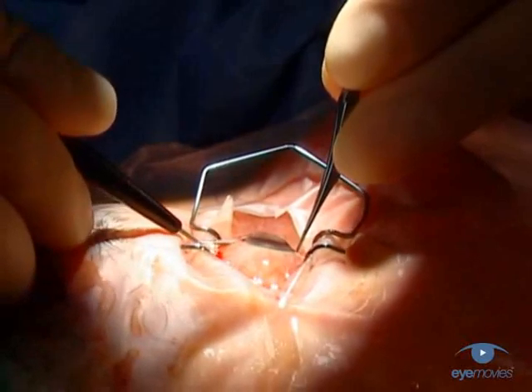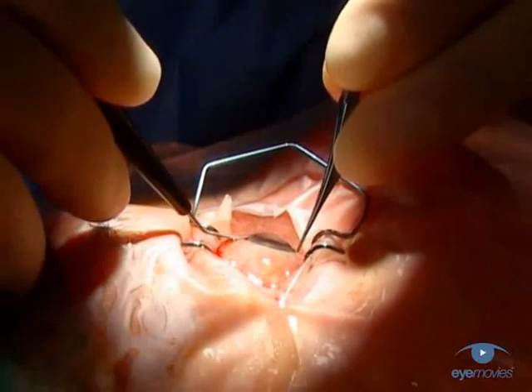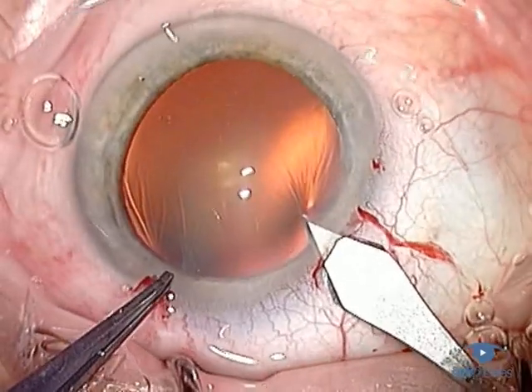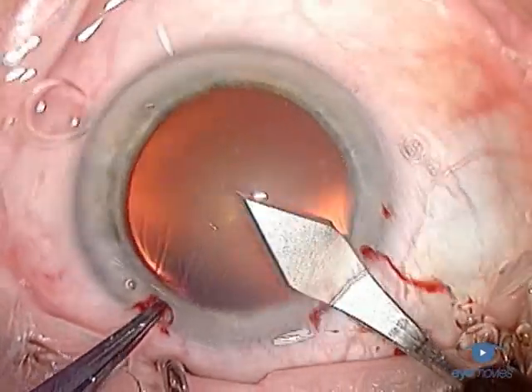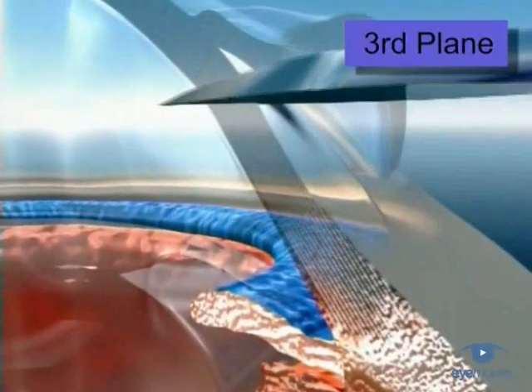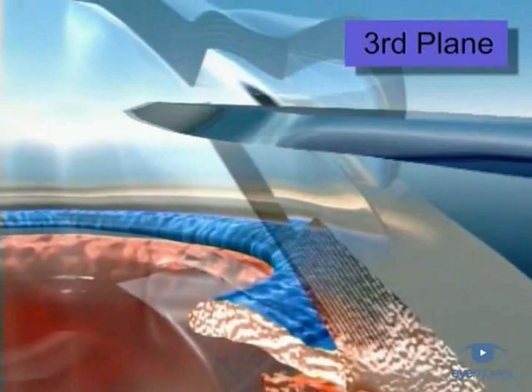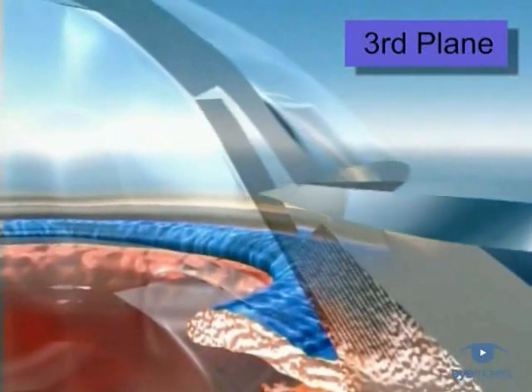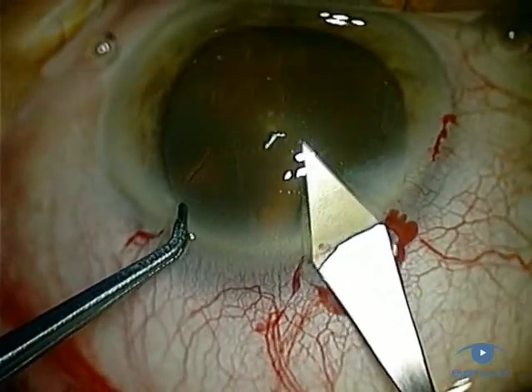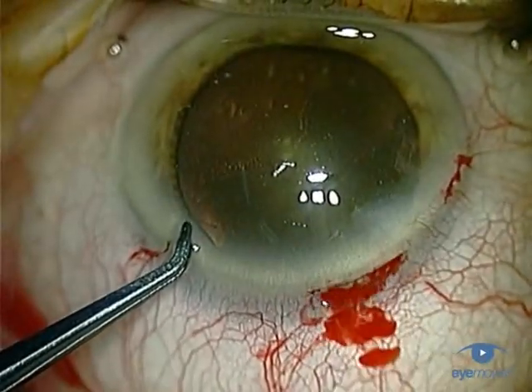You do this by tilting the blade heel up and toe down. As you do so, you'll usually see the characteristic corneal dimple appear from the localized pressure of the tip. What this angled entry achieves is the third incision plane that goes through the floor of the tunnel to connect it to the chamber. It's often performed in any case during an intended two-step incision if you need to enter the chamber more acutely because the tunnel's already long enough.